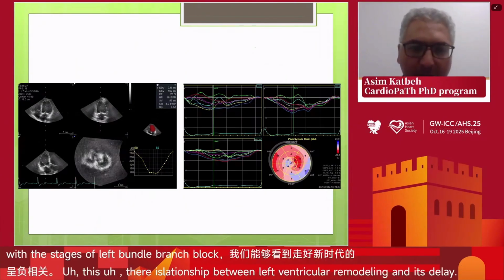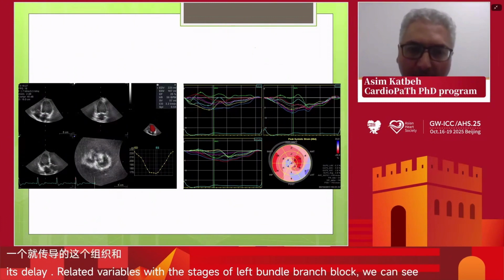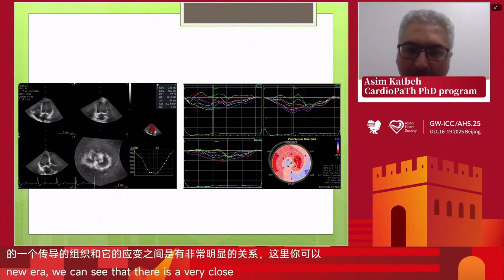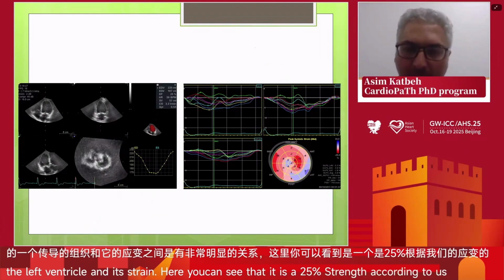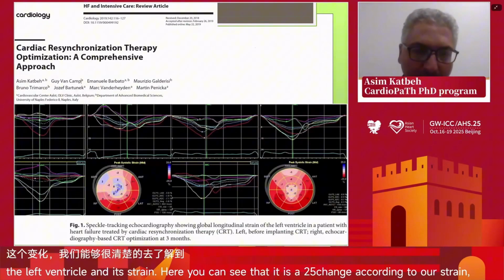This is an example of a patient with heart failure with low ejection fraction, EF 25%, and a GLS value of 5.9. And you see, based on the strain curve, the dyssynchrony between the septal segments compared to the posterior and lateral wall segments.